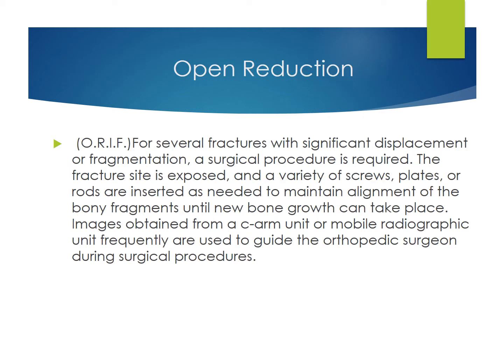Open reduction, ORIF. For fractures with significant displacement or fragmentation, a surgical procedure is required. The fracture site is exposed, and a variety of screws, plates, or rods are inserted as needed to maintain alignment of the bony fragments until new bone growth can take place. Images obtained from a C-arm unit or mobile radiographic unit frequently are used to guide the orthopedic surgeon during the surgical procedures.